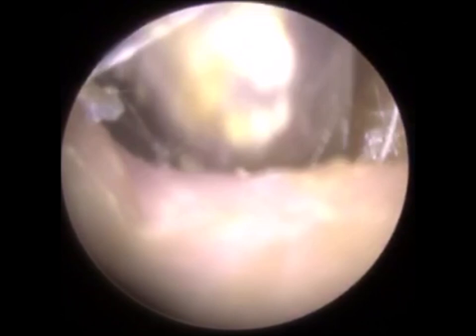And this part of the ear is becoming a lot easier now. So we're probably about 3 centimeters into the ear canal. You just see how wet and damp that is. And this is a large piece of keratin that I removed, just mopping up near the entrance. And you can just see the perforated eardrum there. When I vacuum this, it should reveal itself.